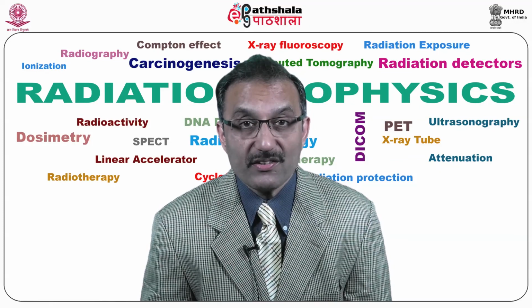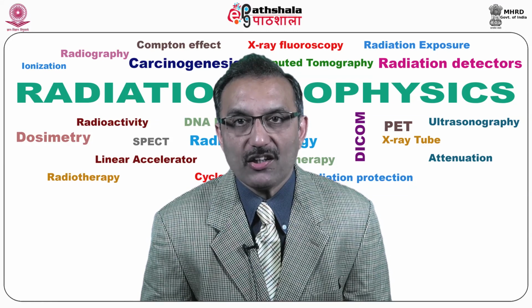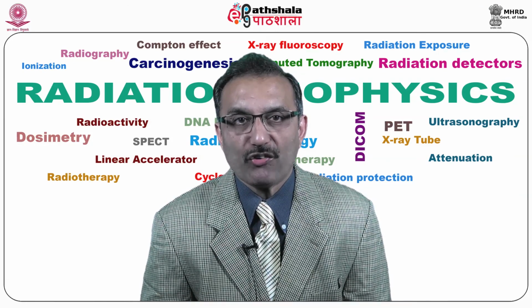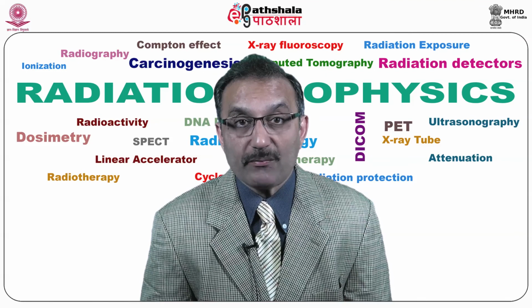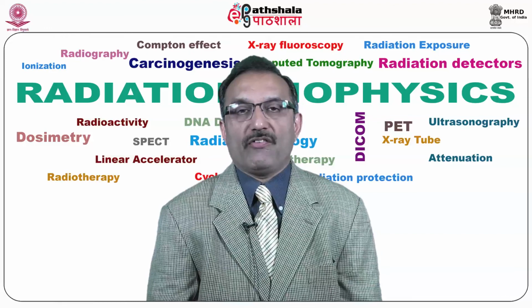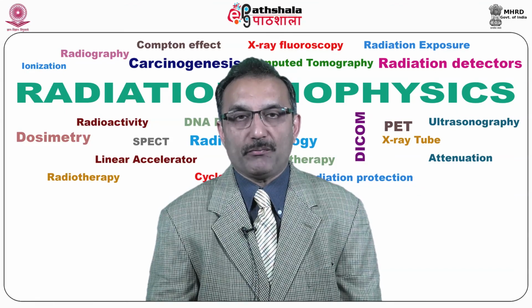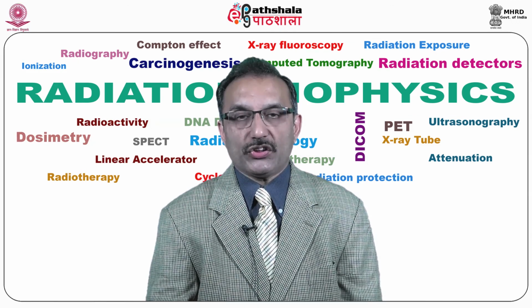Again, the radioactive substance may expose radiation to the fetus in patients who are pregnant, or to the infants of women who are breastfeeding. The risk to the fetus or infant should be considered in relation to the potential information gained from the result of the PET examination. If you are pregnant, you should inform the PET imaging staff before the examination is performed. For any nuclear medicine examination, if a woman is pregnant, she has to inform the staff before any radioactivity is administered, because it may pose some risk to the fetus.